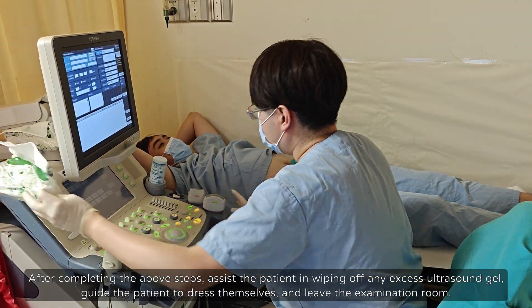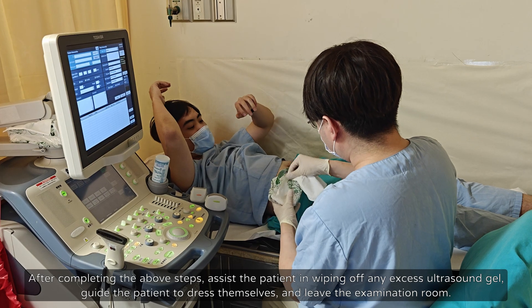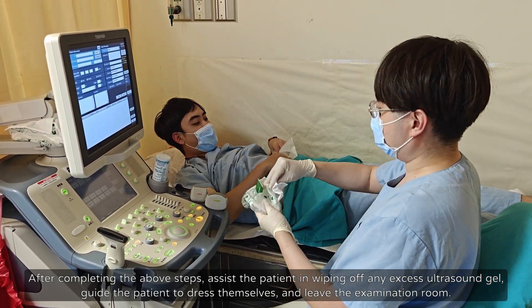After completing the above steps, assist the patient in wiping off any excess ultrasound gel, guide the patient to dress themselves, and leave the examination room.